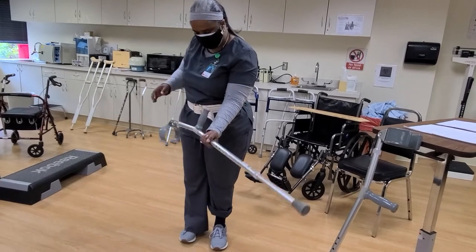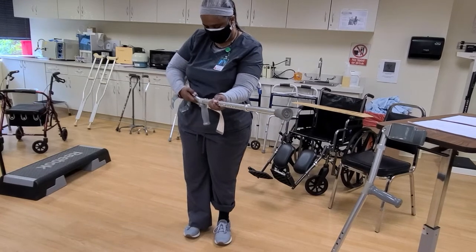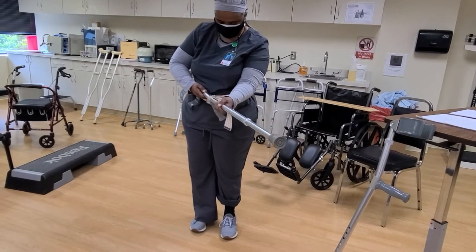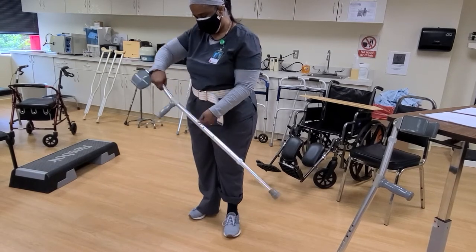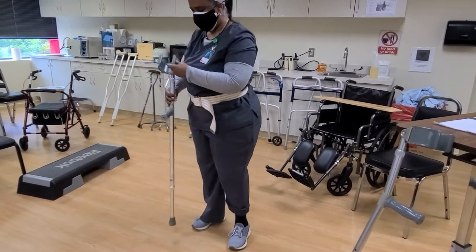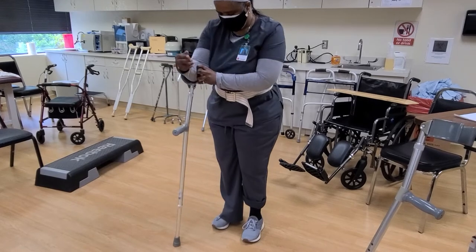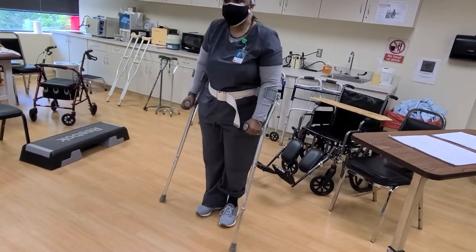Then I want to adjust the wrist height. I can adjust this by moving it up and down. That's even better. They're both just below my elbow.